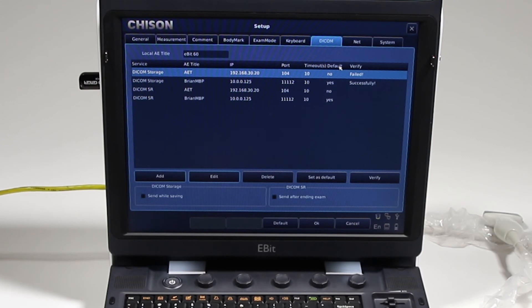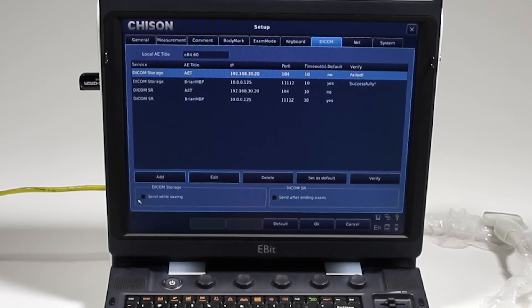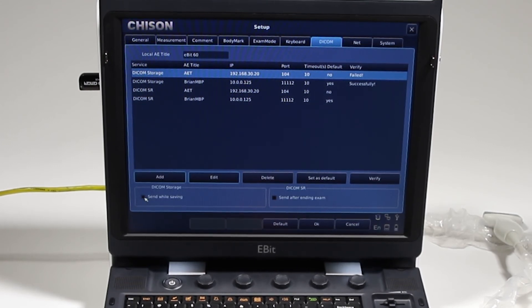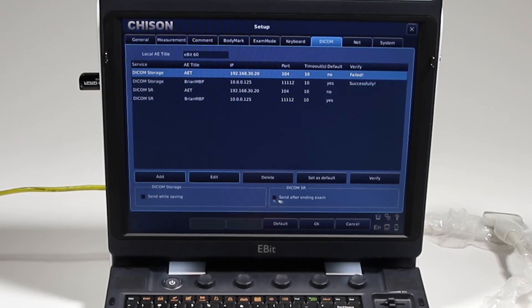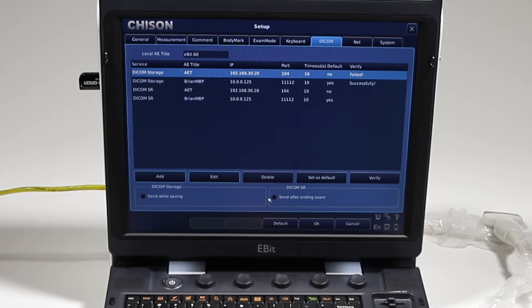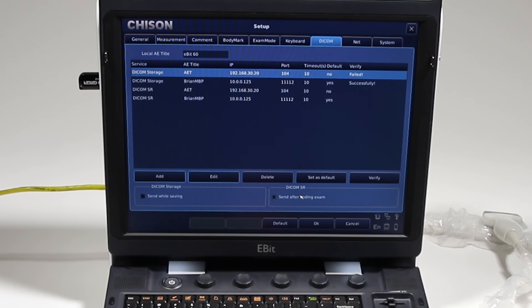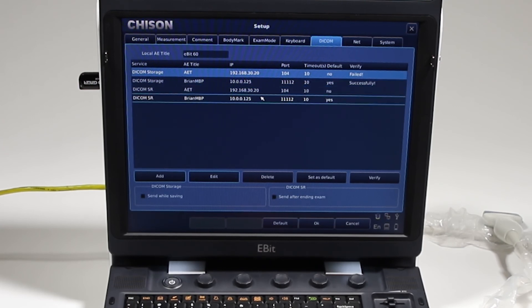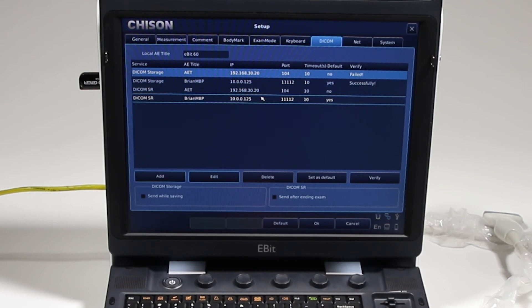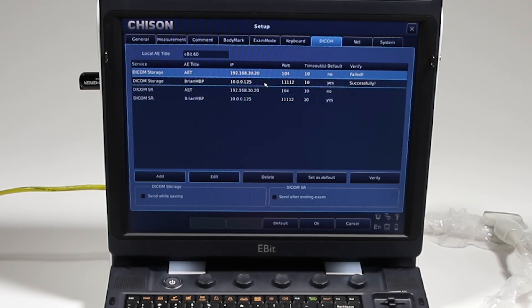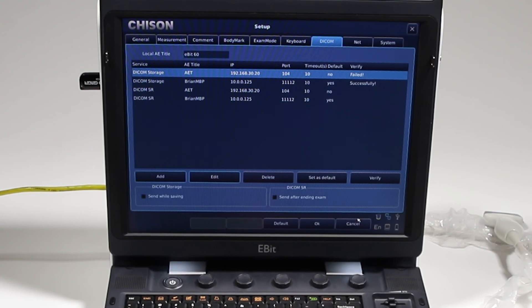Down along here you can send while saving, so it automatically goes to the DICOM server each time you save an image. And DICOM structured report, you can also send after ending the exam. The report will go automatically to the DICOM server. One other thing is if you are sending DICOM structured reports at this time on this machine, you do have to send in two different exports. So when we went through that export screen, I'll just go to that real quick.